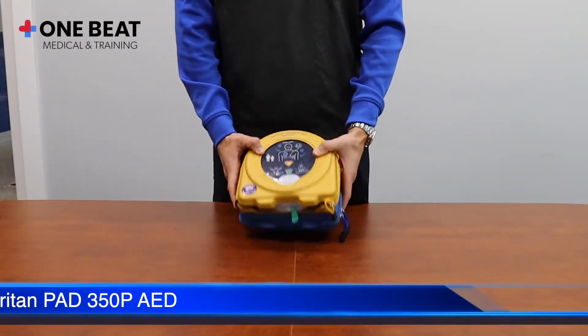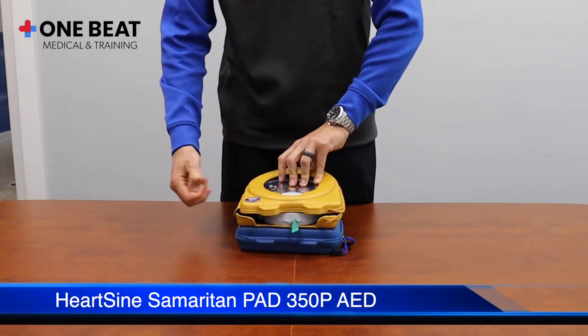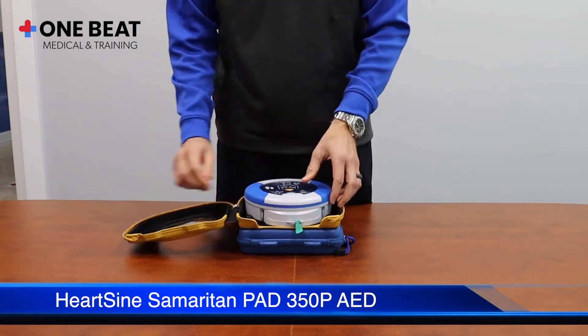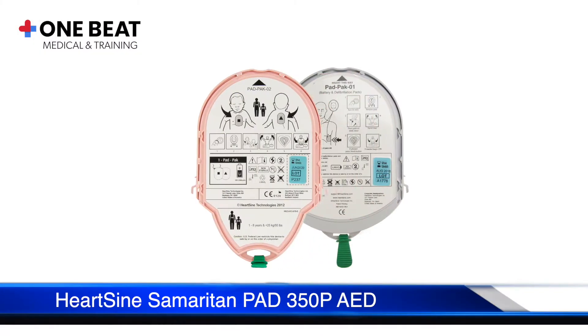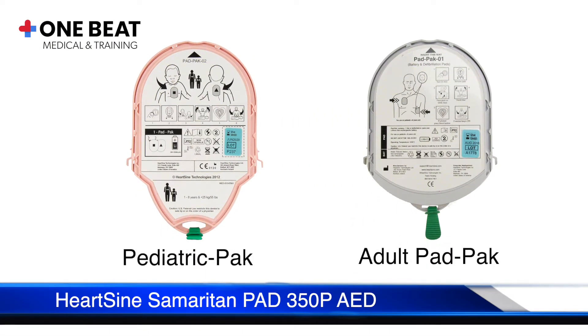This is the HeartSine Samaritan PAD 350P. When you get the device, the pad pack will be separate, so let us show you how to install it. There are two different pad packs available for this device: for children age 1 to 8, and for adults weighing more than 25 kilograms.